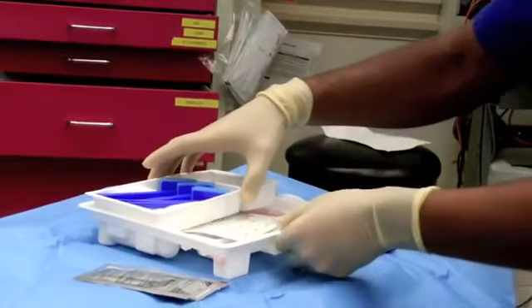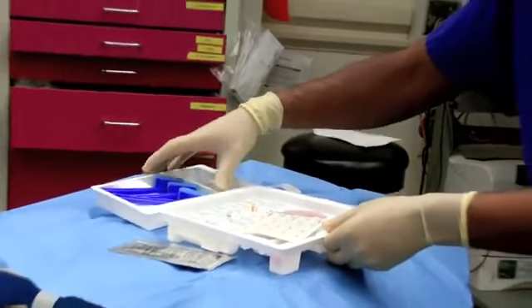I'm going to verify the content of the anesthetics before drawing them up.